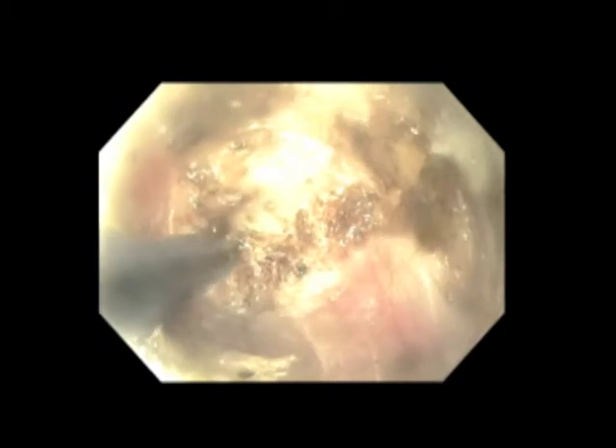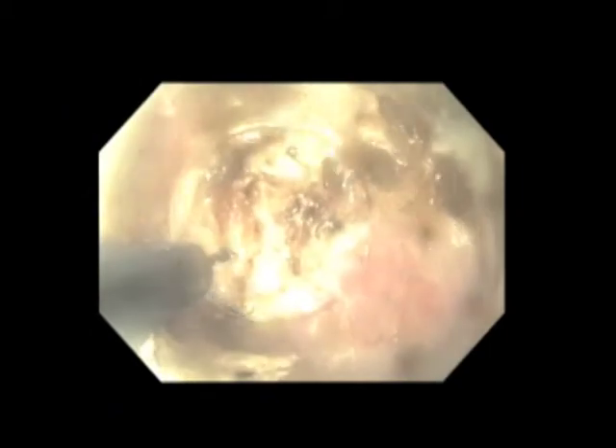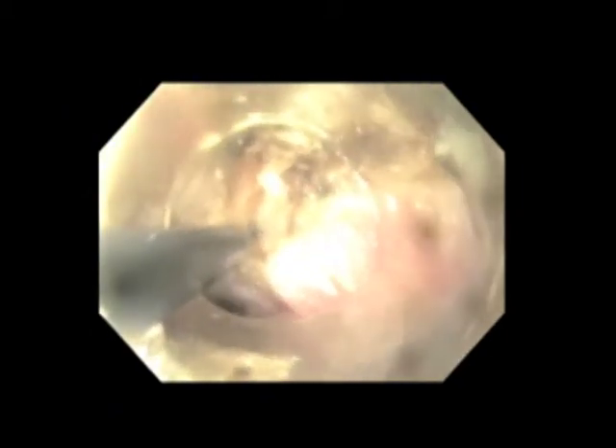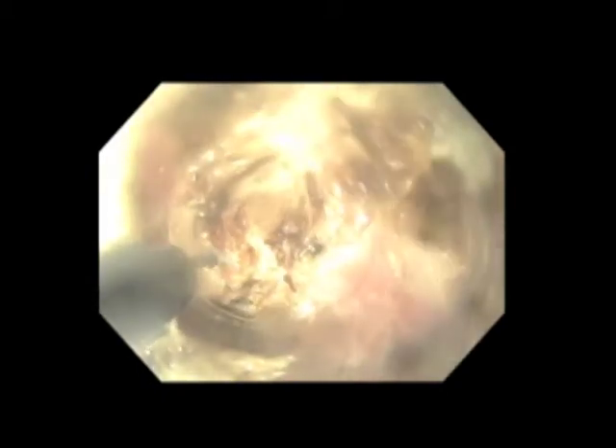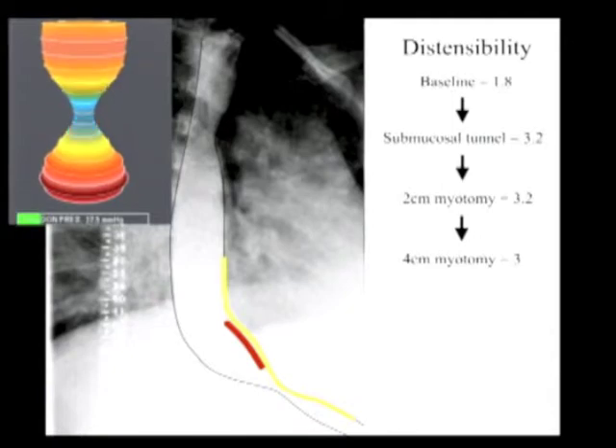The myotomy is then continued another two centimeters. In contrast to Heller myotomy, during POEM only the inner circular muscle fibers are divided. This leaves the longitudinal fibers as a safety margin in order to help avoid injury to mediastinal structures. After a total of four centimeters of proximal myotomy, we can see that there's still been no change in EGJ distensibility.